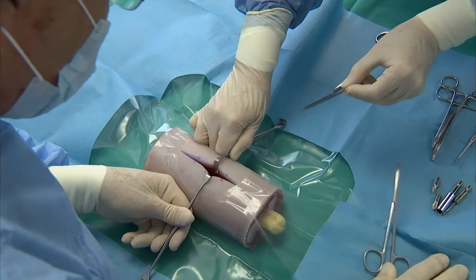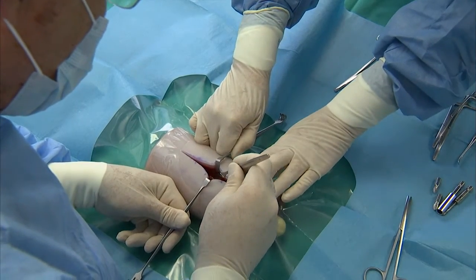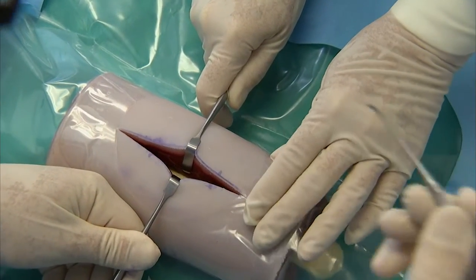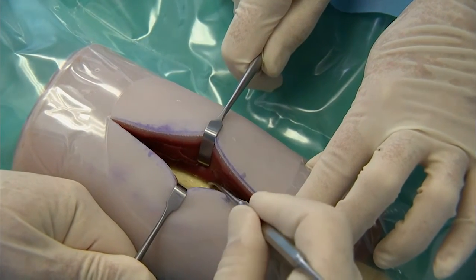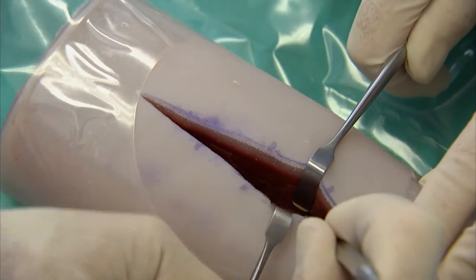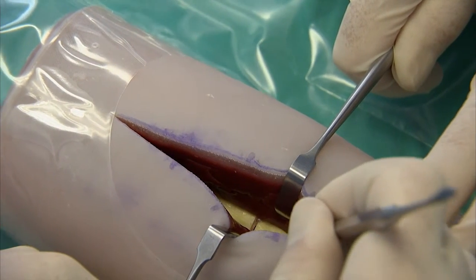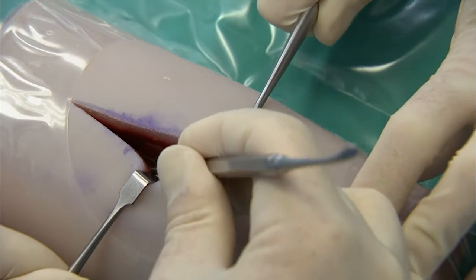When the operator is close to the bone, he or she makes the final cut with a scalpel onto the bone. Use a periosteal elevator to expose bone over the fracture and adjacent areas for visualizing the bone properly. Try not to strip the periosteum too extensively. Visualize the fracture properly and expose sufficient bone on either side of the fracture for accommodating the repositioning forceps, as well as the transosseous plate.